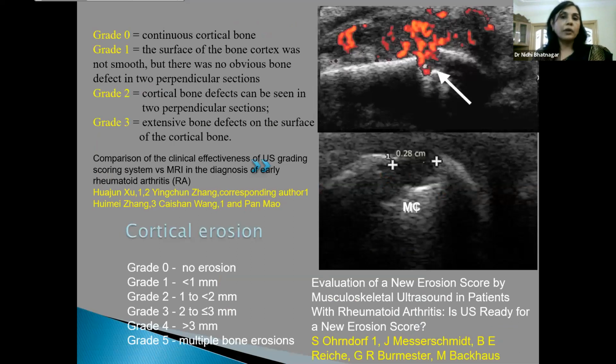A very strong and very important sono sign of moderate rheumatoid arthritis is cortical erosions. And these are predominantly seen on the radial aspect of the metacarpals and of the phalanges. Bone erosion is a central feature of seropositive rheumatoid arthritis, and it is associated with disease severity and poor functional outcome. Now, here is a long axis scan, and on the metacarpal head, you can see conclusive evidence of erosion.